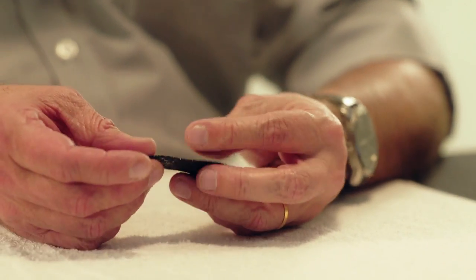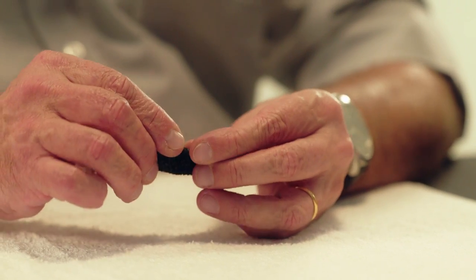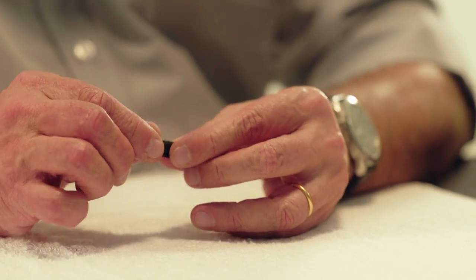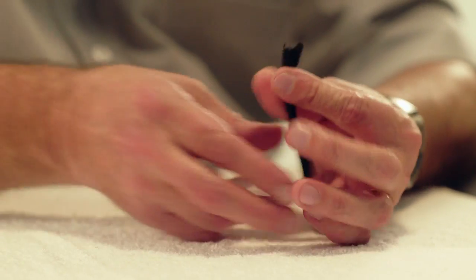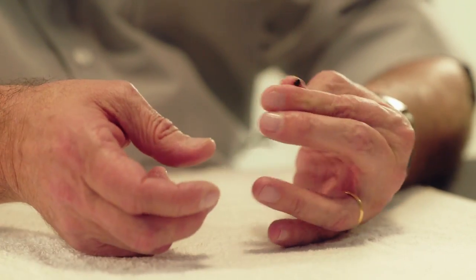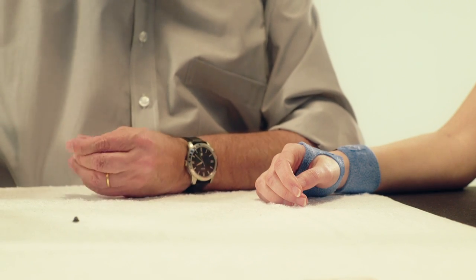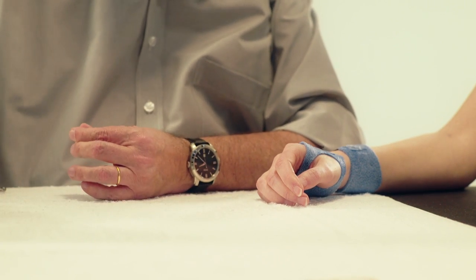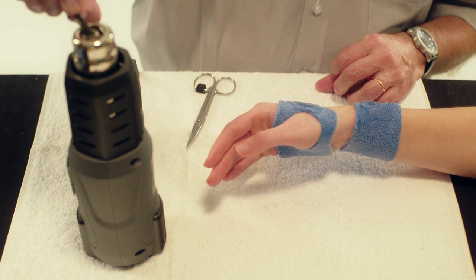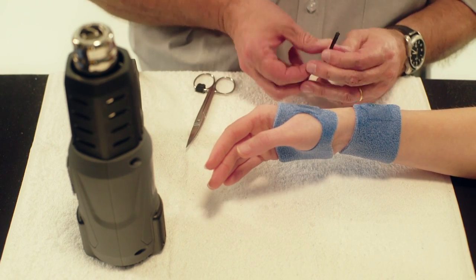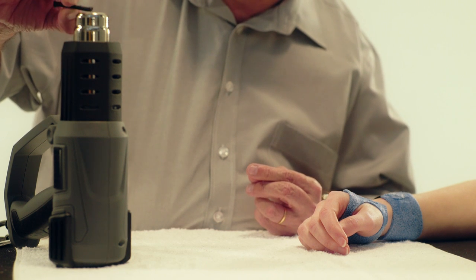Take a small strip of Orphicast and heat it with the heat gun. Roll the Orphicast into a small tube while maintaining a constant pressure. Fit the length of the Orphicast roll onto the radial side of the wrist and cut to fit. Heat both sides of the Orphicast tube with a heat gun and stick them on the radial side of the wrist onto both portions of the orthosis.